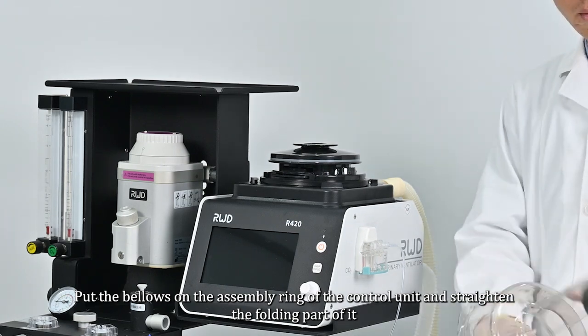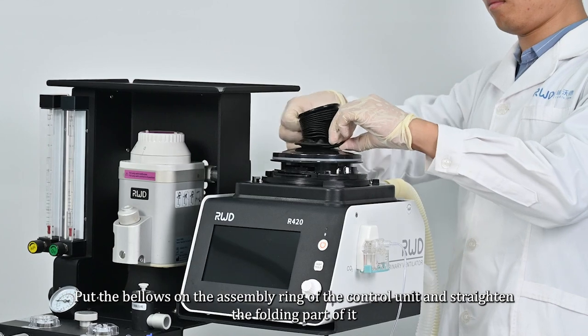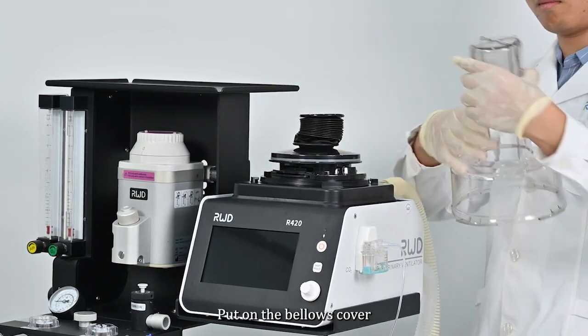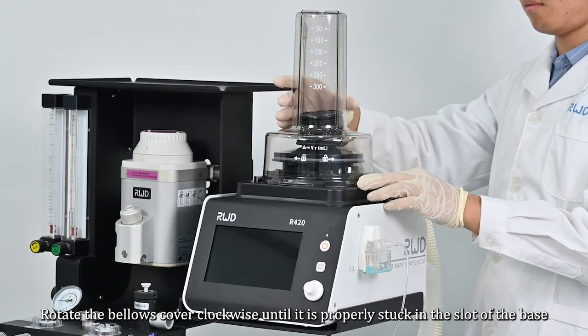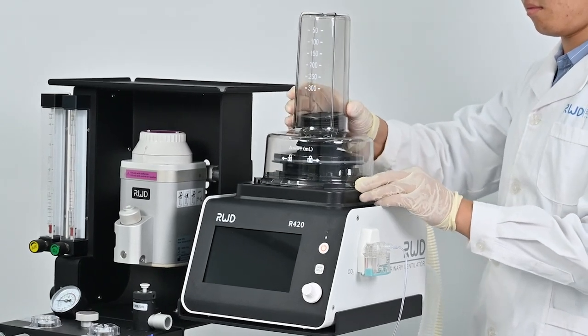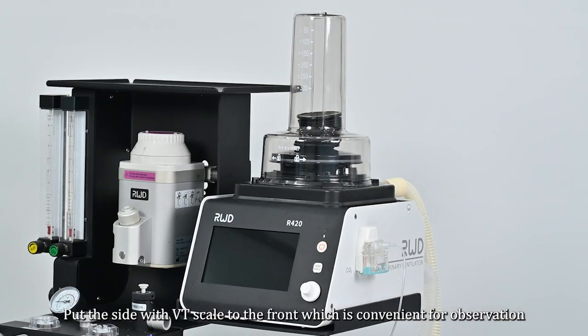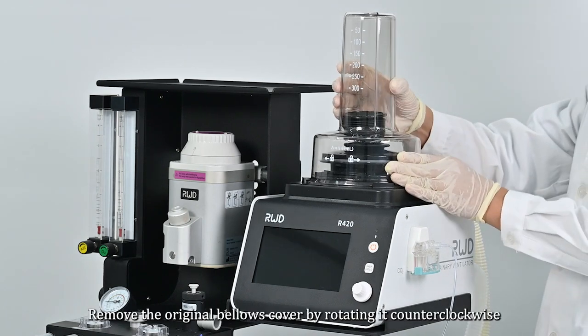Put the bellows on the assembly ring of the control unit and straighten the folding part. Put on the bellows cover and rotate the bellows cover clockwise until it is properly stuck in the slot of the base. Put the side with the VT scale to the front for convenient observation.